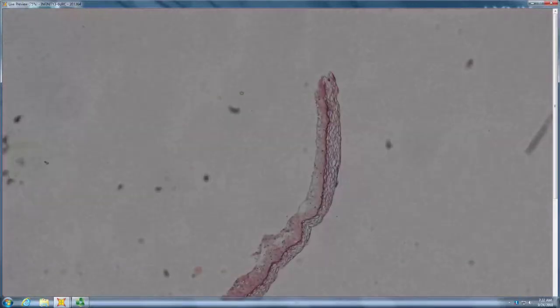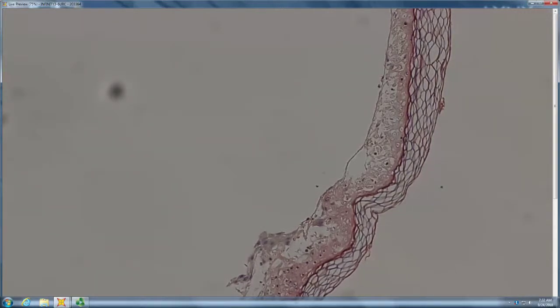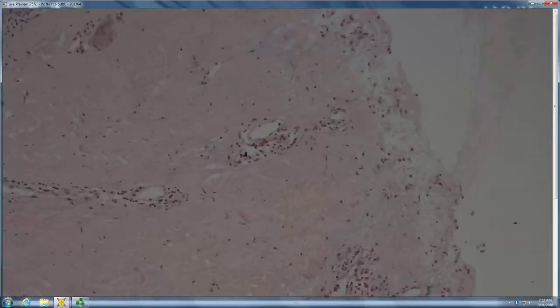So we have some hidden epidermis there. It does look pretty dead and necrotic. Yeah, pretty dead, so it's sloughed off. Yeah, I was thinking like Stevens-Johnson, TEN, from EM. So EM spectrum disease, EM, TEN, Stevens-Johnson, which would be very, very reasonable.